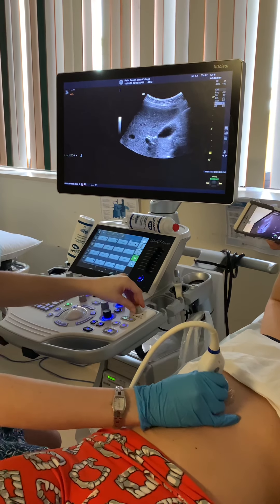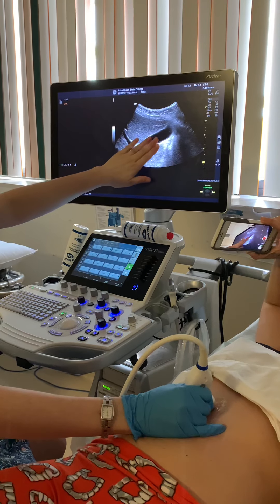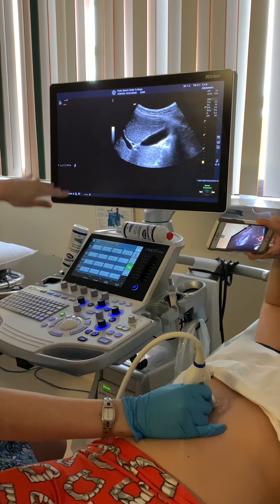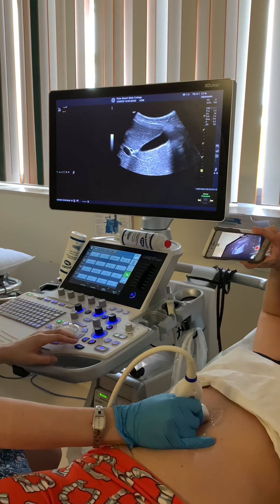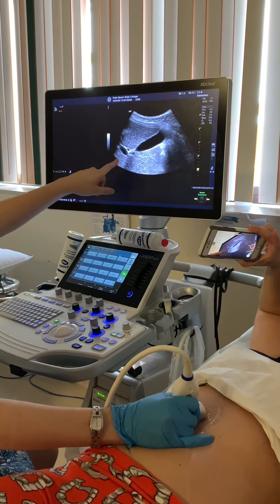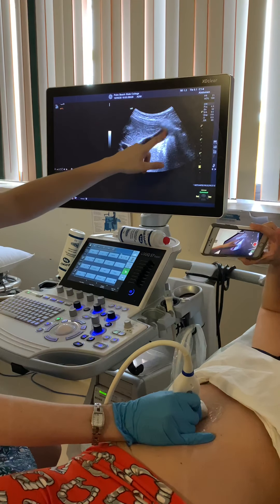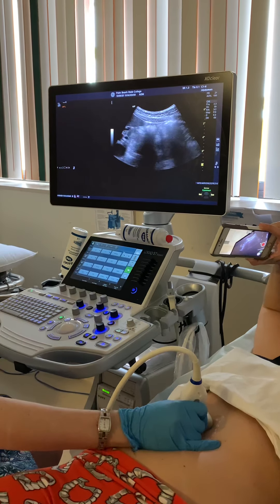It doesn't matter if we cut some of our liver off because we're not focusing on the liver — we're focusing on our gallbladder, so we don't need the whole liver in there. We're going to start off in sagittal. This is our sagittal gallbladder in the long axis, kind of shaped like an exclamation point. You have your portal vein and then you have your gallbladder. When you're ready, take another breath in and hold it.